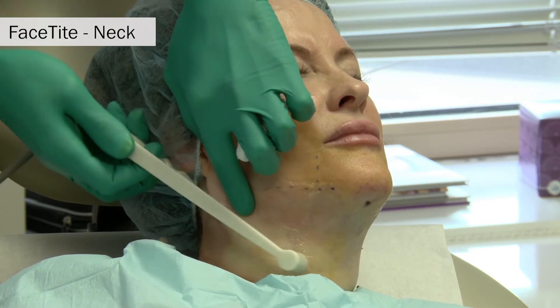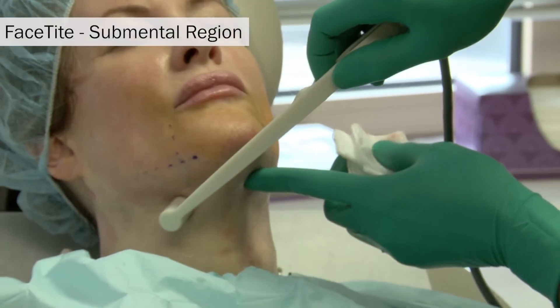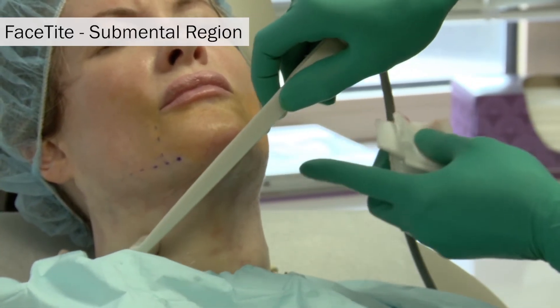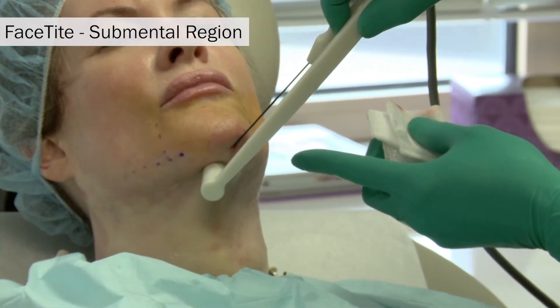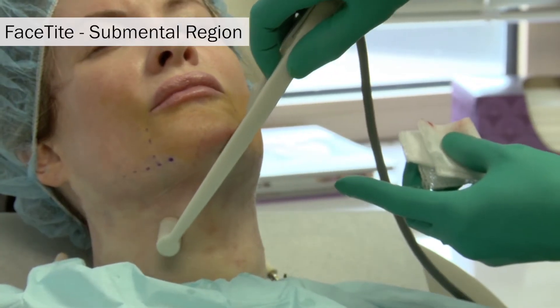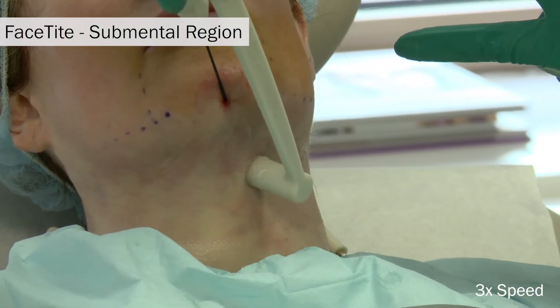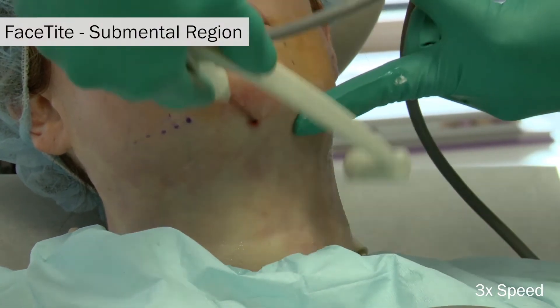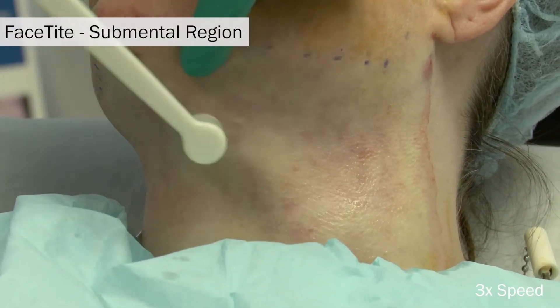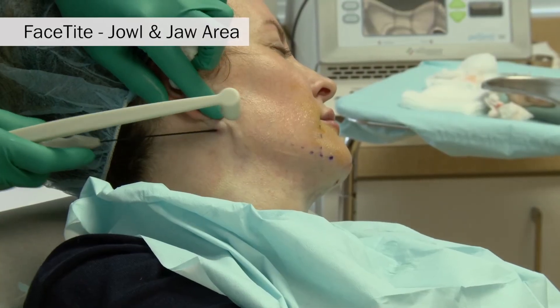Once the appropriate amount of energy and time has been spent on the lateral neck, attention then moves to the submental or central neck area, treated in much the same way as the lateral neck. The probe is radially fanned from the submental crease port or pilot hole. When treating the central area, most of the lateral treated area has also previously been treated, which is why less energy can be placed there.